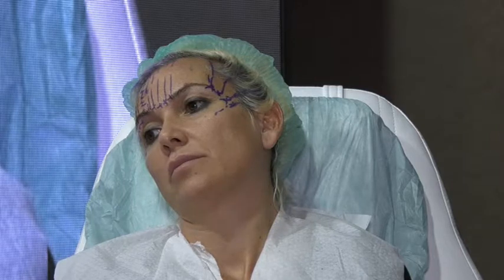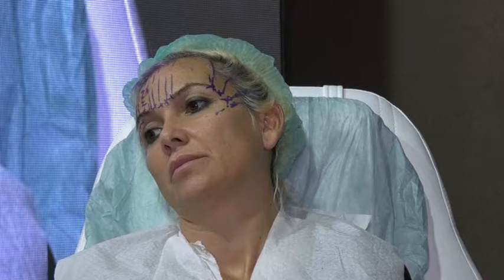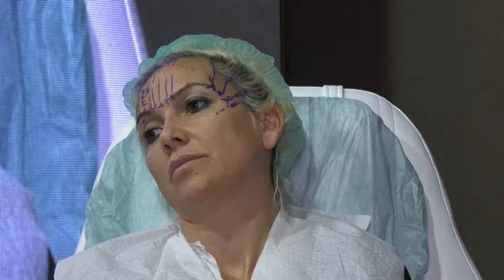So we will start from down to have a better result. We start from down to have more fixation up, because the thread at the end is exactly like this pen. Do you know the thread is exactly like this pen?